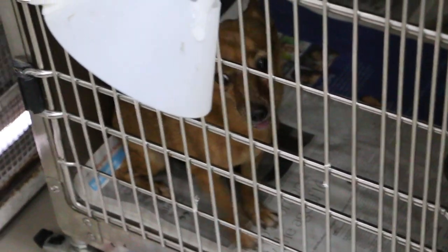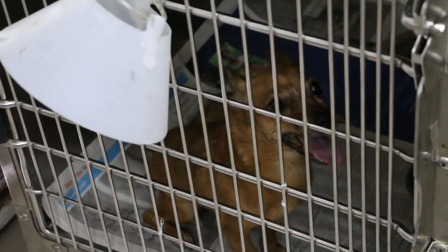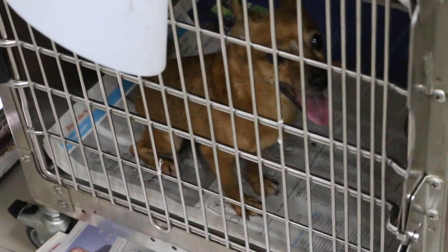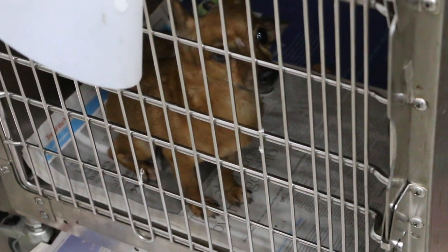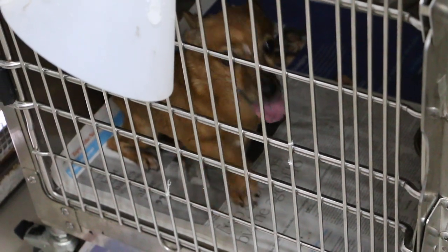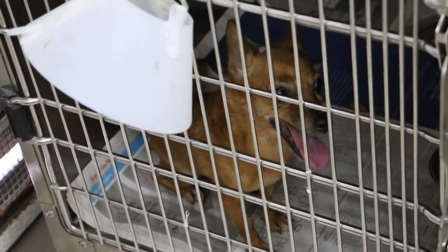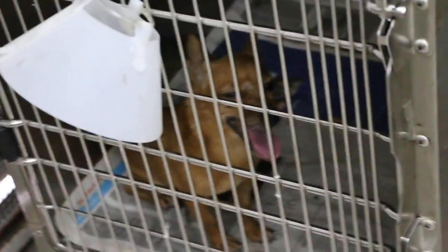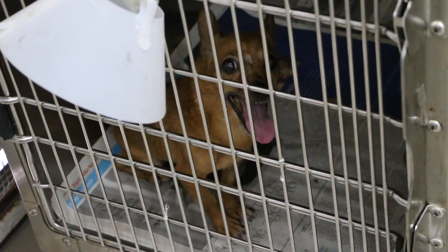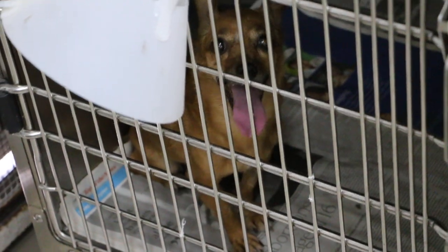This dog was in another clinic from 27th of November and came here on December 4th. The first clinic had already tested the dog and discovered azotemia. They suspected leptospirosis, did the IDEXX SNAP lepto test, and it was positive. The dog presented with signs of lethargy, not interested in eating, and soft stools.